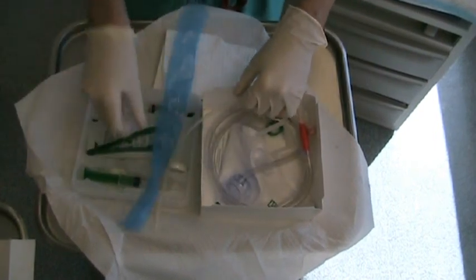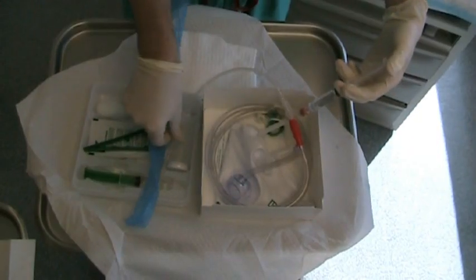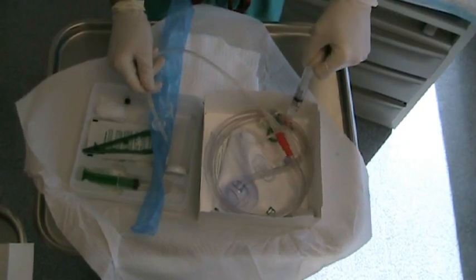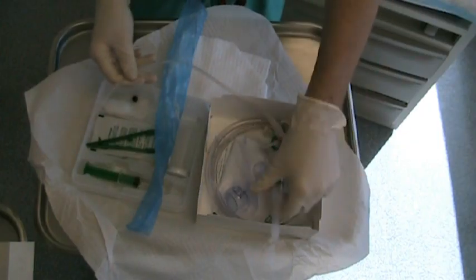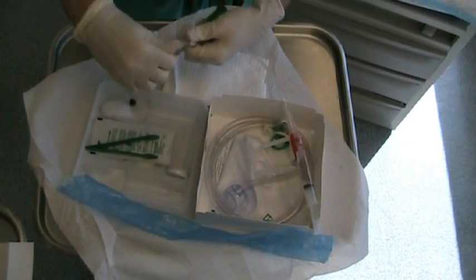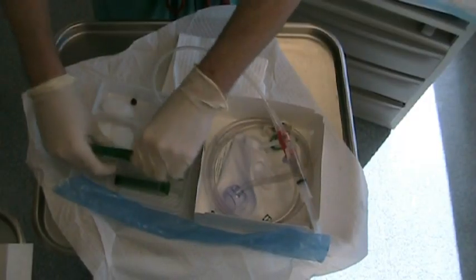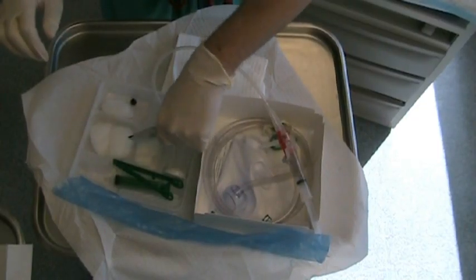The catheter balloon should be tested with the included saline. The lubricant jelly is emptied into the small tray and the tip of the catheter is well lubricated. Empty the betadine onto each of the cotton balls.